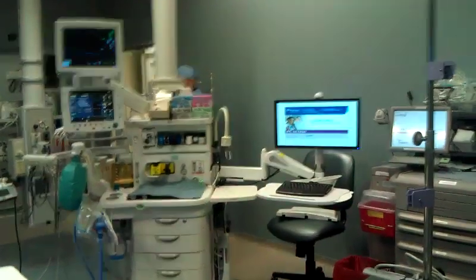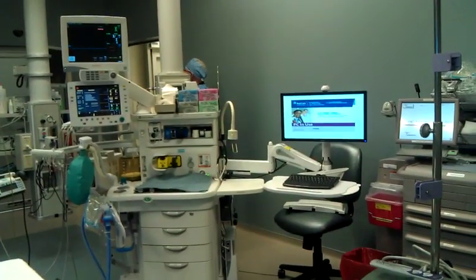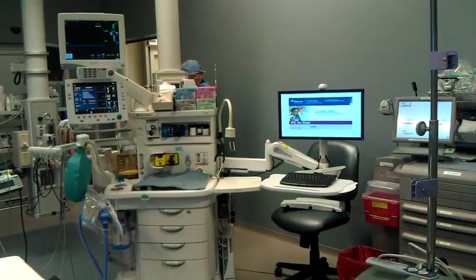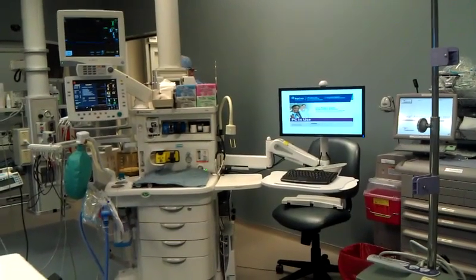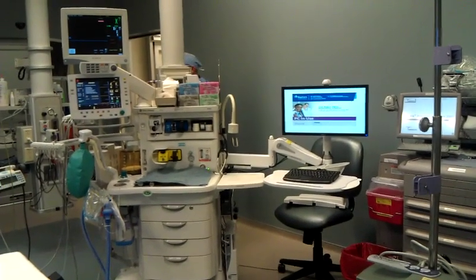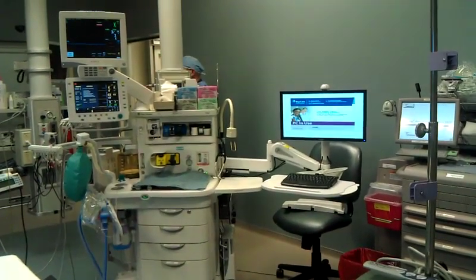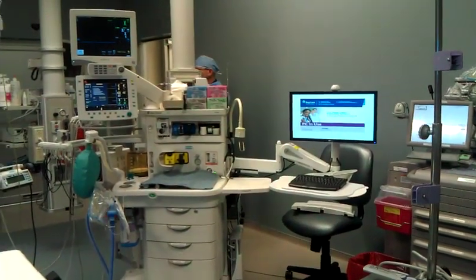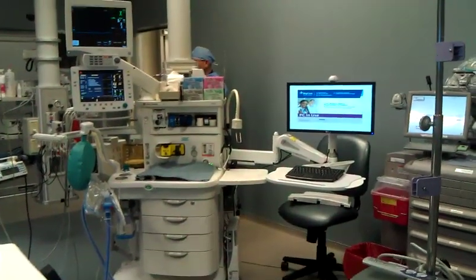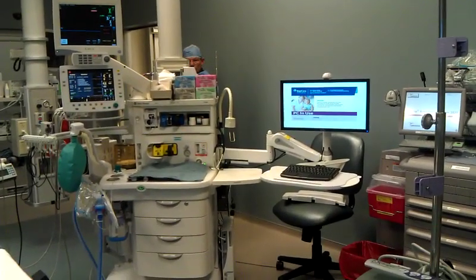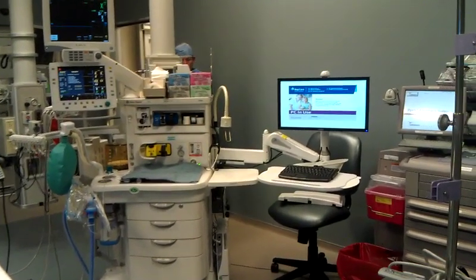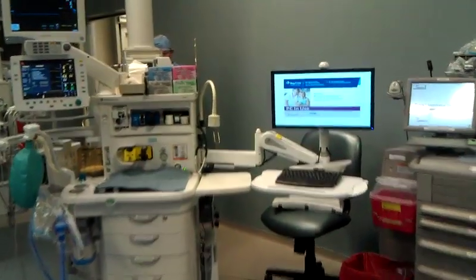I just wanted to give you an overview of the anesthesia machine, because a lot of our points of failure for IBUS may happen from loose connections. This is the anesthesia machine itself.